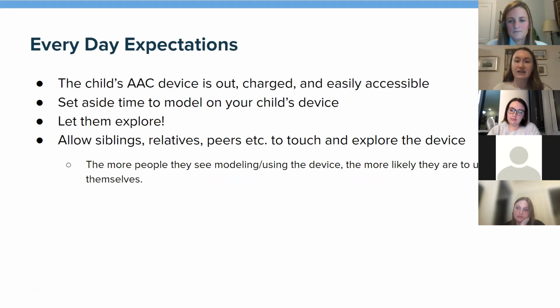So first, having the device out, charged, and easily accessible. Setting aside a time to model on the child's device. Pick an amount of time that works for your family, for your schedule, whether it's 10 minutes a day, 30 minutes every other day, again, whatever works for you guys.